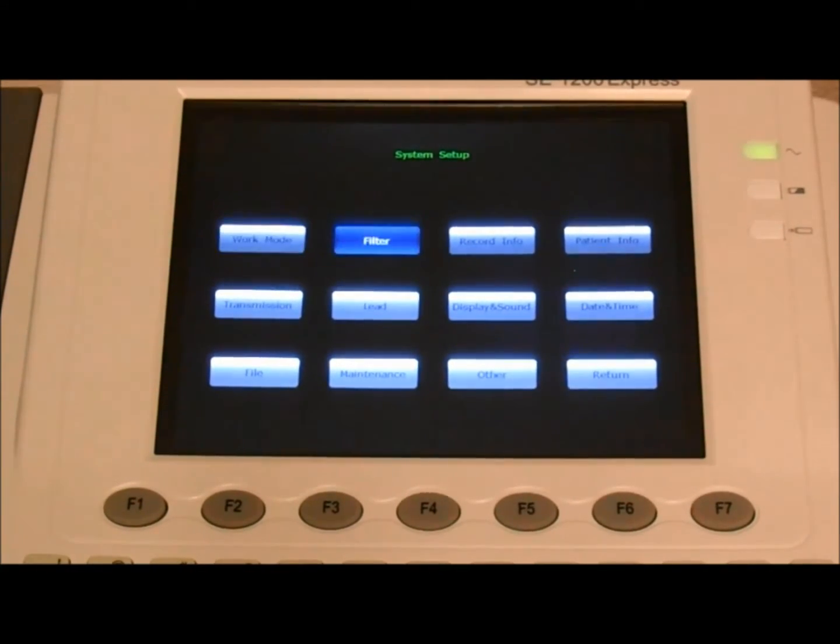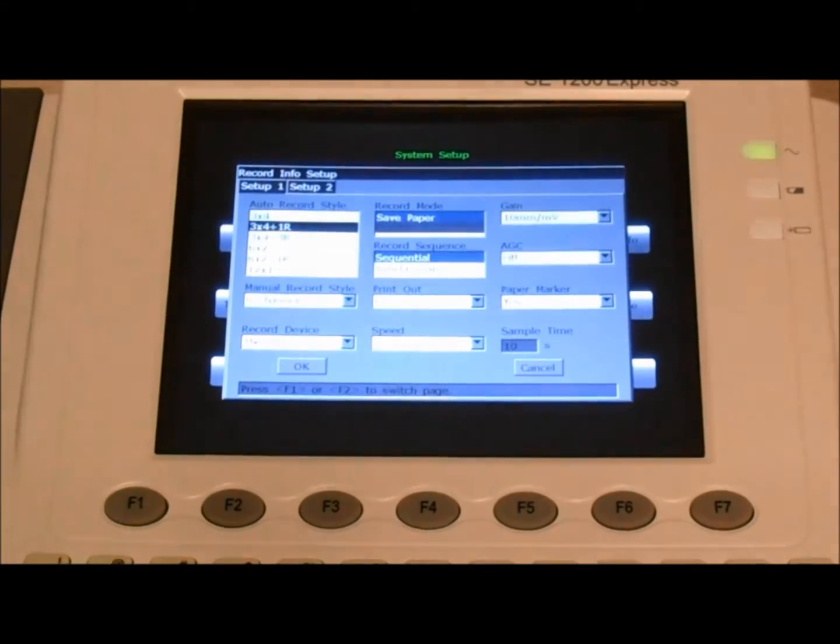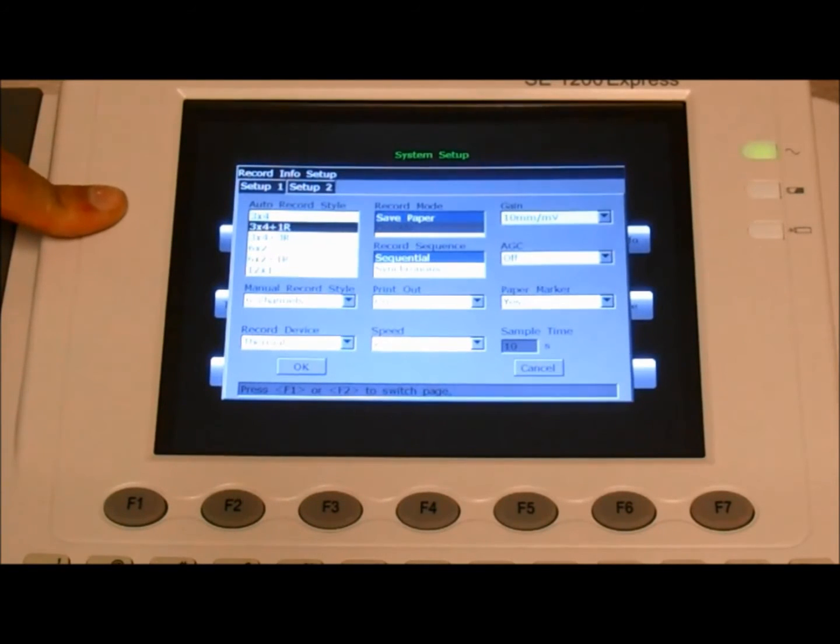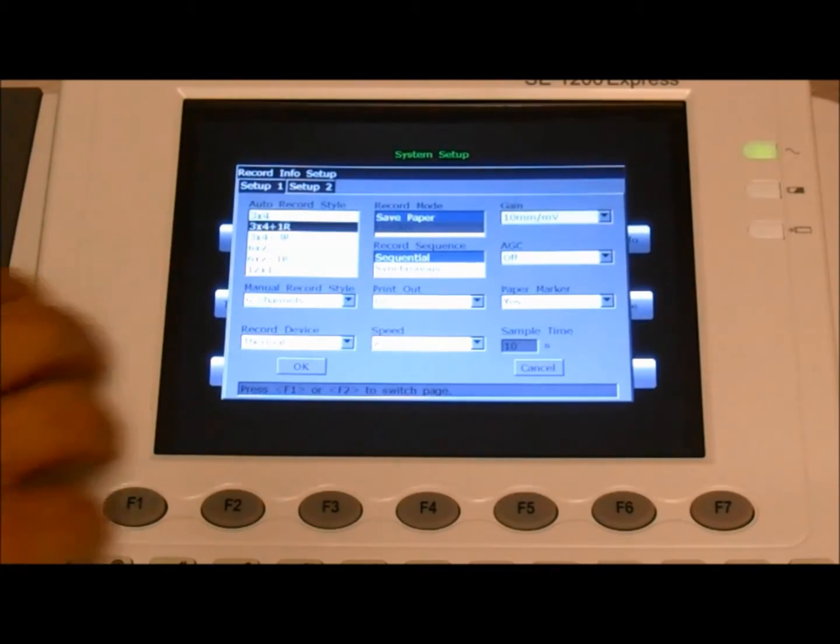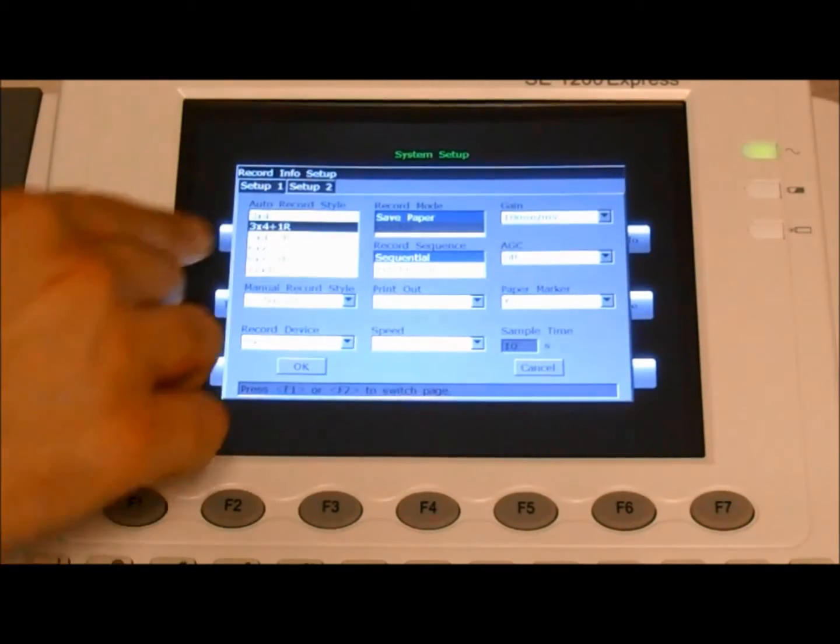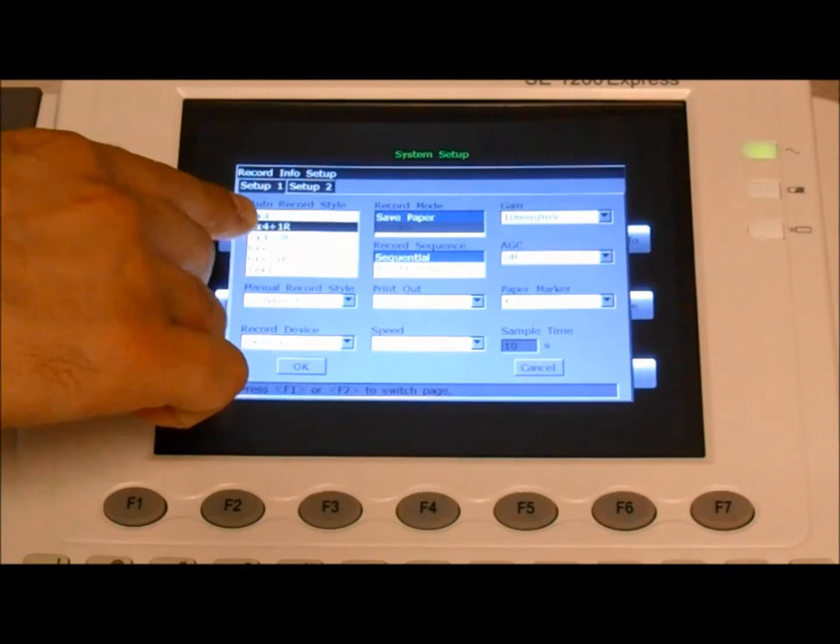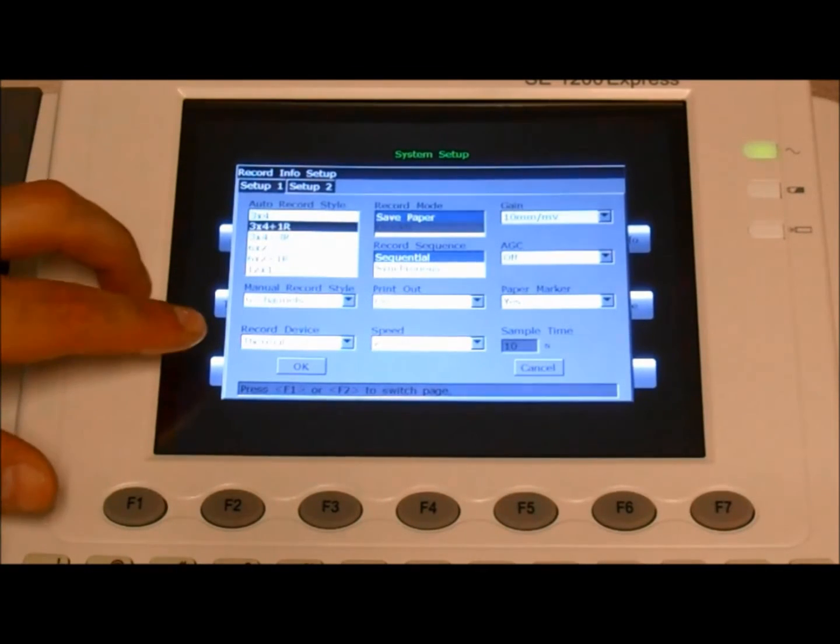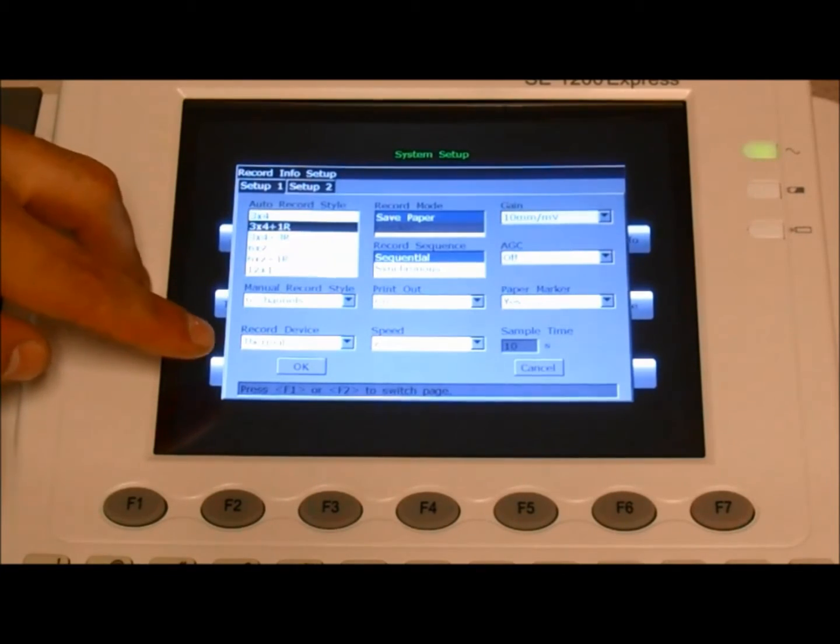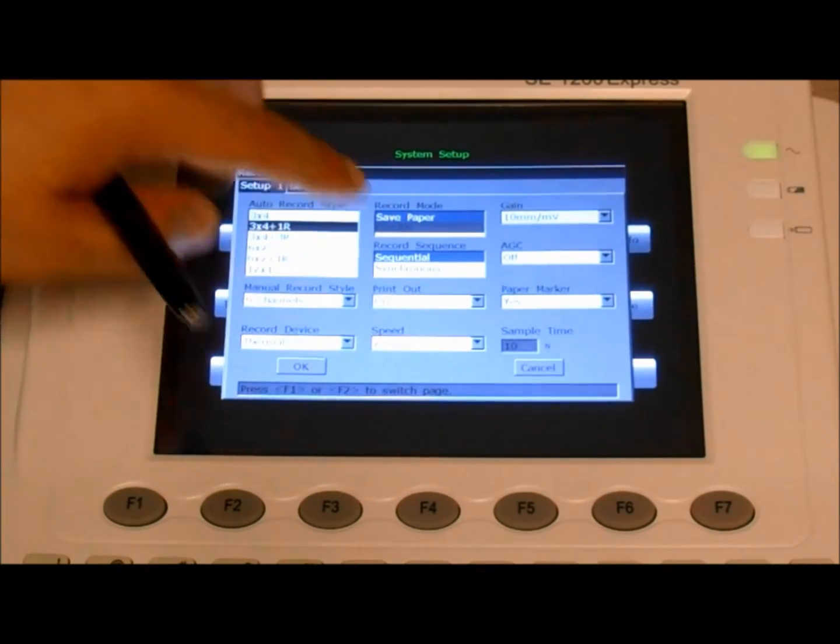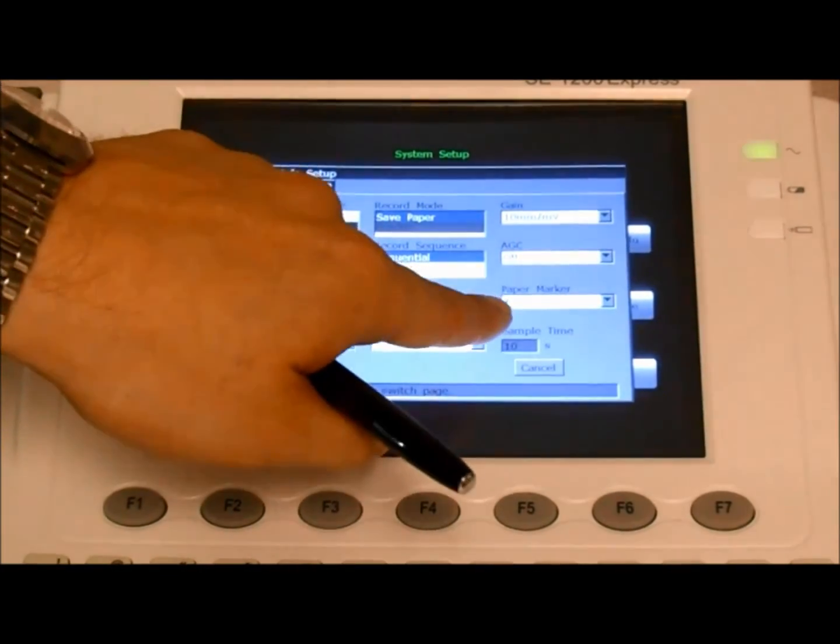Next, we select record info. Under auto record style, this is where we control how the information is printed on the report itself. So in order to match the display, we'll set it at three by four plus one R. Record device, make sure it says thermal to get the recording on the EKG itself. And paper marker has to be yes.